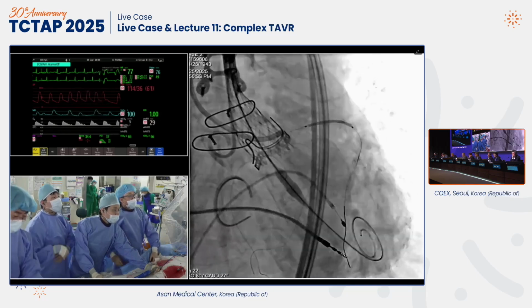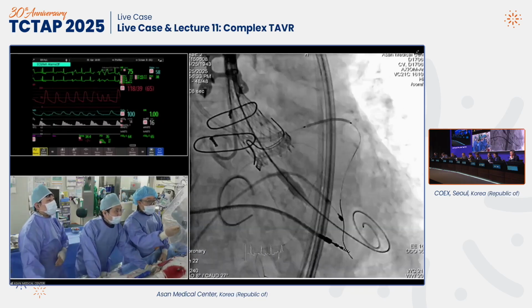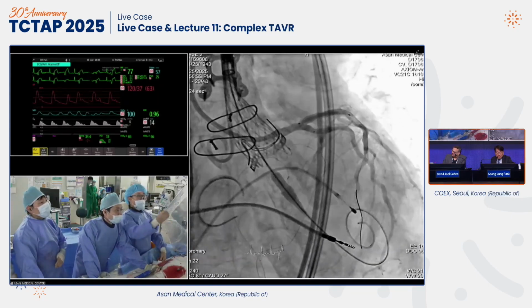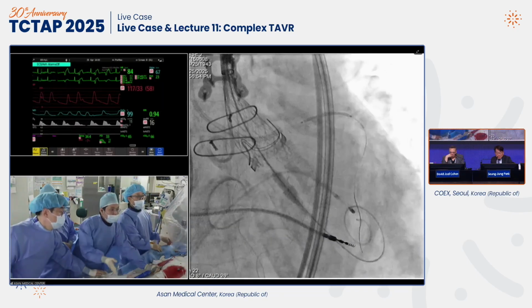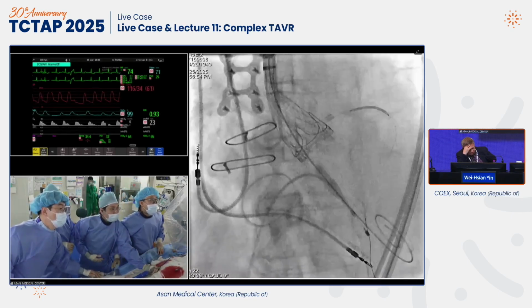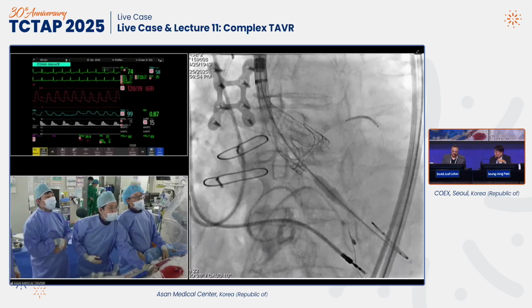Good. Some intubation of the guiding catheter would be better. Absolutely. Position-wise, it looks good. There was a question about whether you should deploy it lower, but I don't know. The inflow level is the same. Let's go to a cut view here. I think it's too high. Because there's a -1, so it's a depth of 1 maybe. I think we need a little bit, it's too shallow.